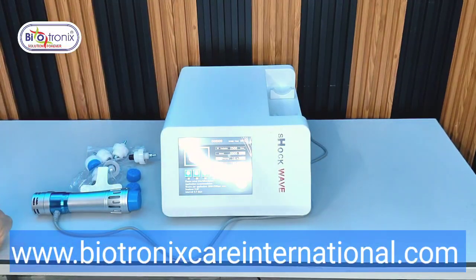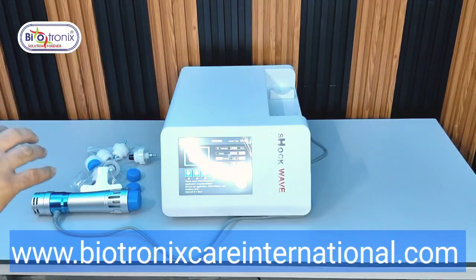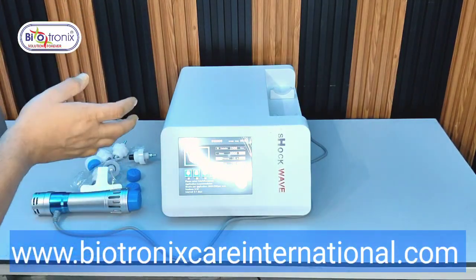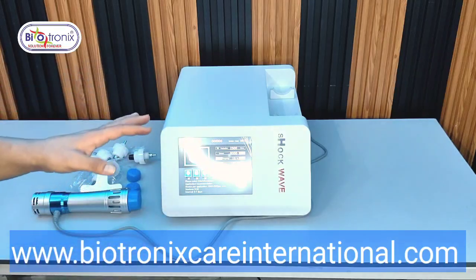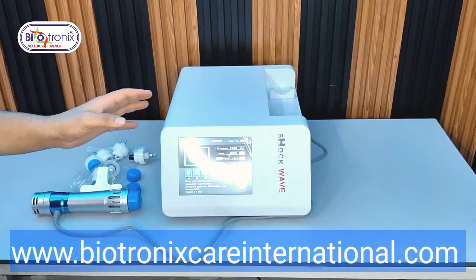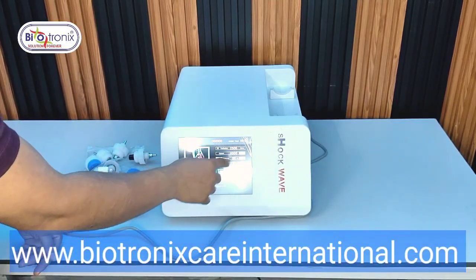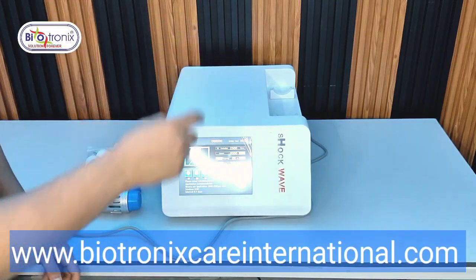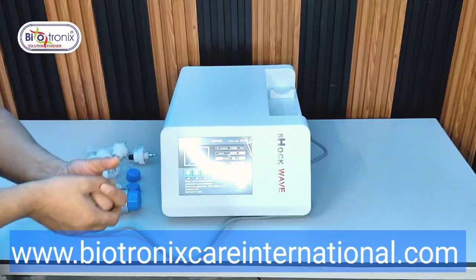So you can go up to 200 millijoule, but in the elbow section, if you use 200 millijoule, that will hurt the joint. So the maximum over here is 100. You can go up to 100. So it depends on the joint: if you go to the hip joint, you can see the energy over here, you can go up to 200 because the area is bigger, the joint is bigger. So you can go up to a maximum of 200.